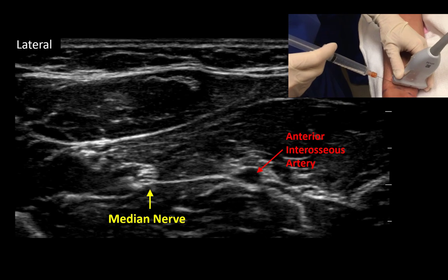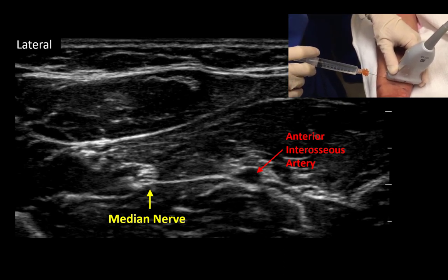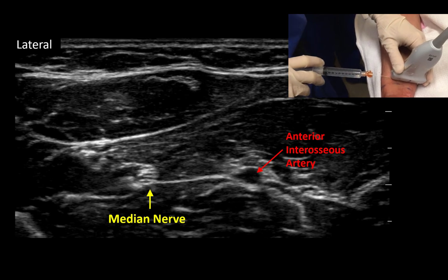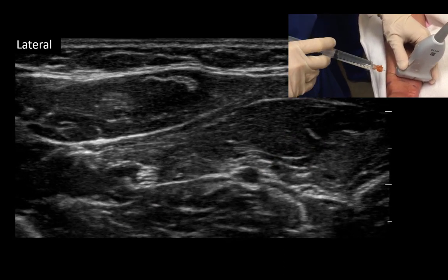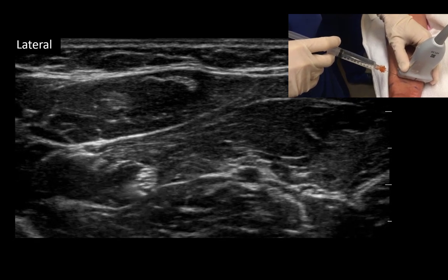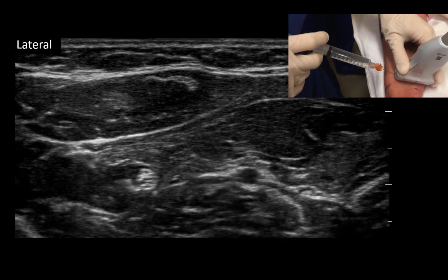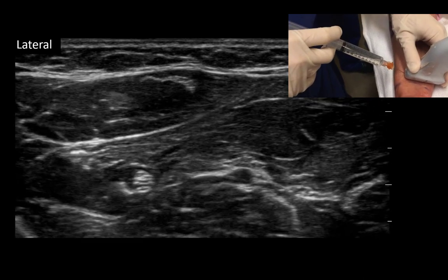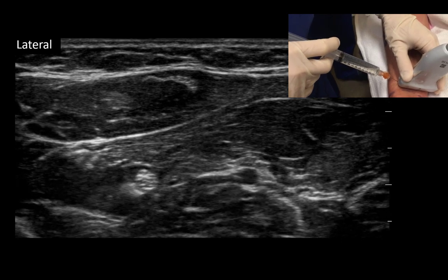In this example the median nerve is targeted using a single-operator technique with a 25 gauge hypodermic needle. The sharper tip pierces fascia with less effort and minimal tenting. Mechanical trauma is avoided by always keeping the needle tip tangential to the nerve and performing slow, continuous injection during needle advancement, creating a fluid jet that pushes the nerve away.